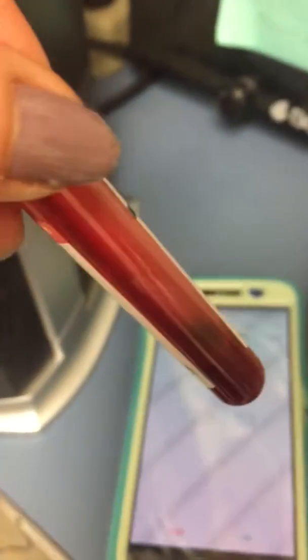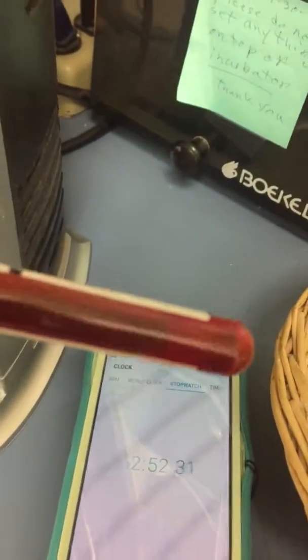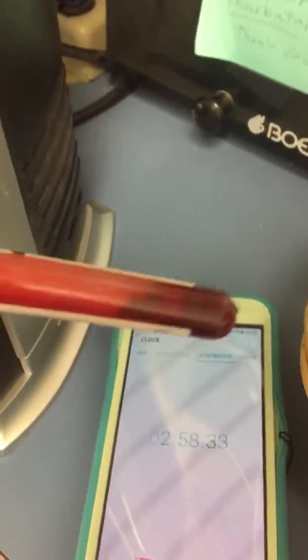It still hasn't clotted. So that's the first indication — it's starting to clot, as you can see, at 2 minutes 54 seconds. And it's clotted at 4 minutes on the last finger — that's the second finger. Clotted at 6 minutes.